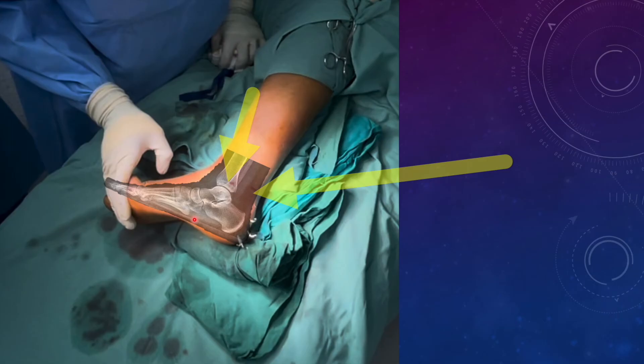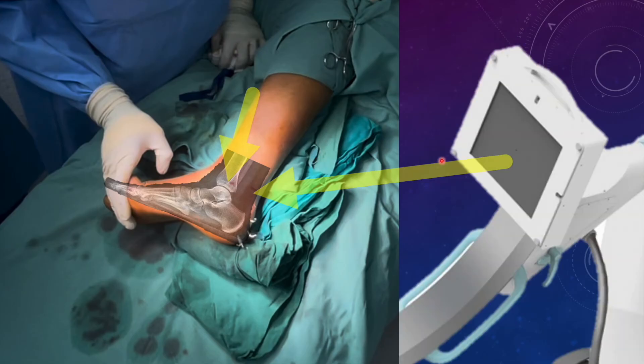So in this technique, what we do is position our C-arm at an oblique direction to the operating table and ensure that the foot end of the table is free. You need to select an operating table in which the foot end is free so that the opposite part of the C-arm console comes on the free end of the table without being blocked by the operating table stand.